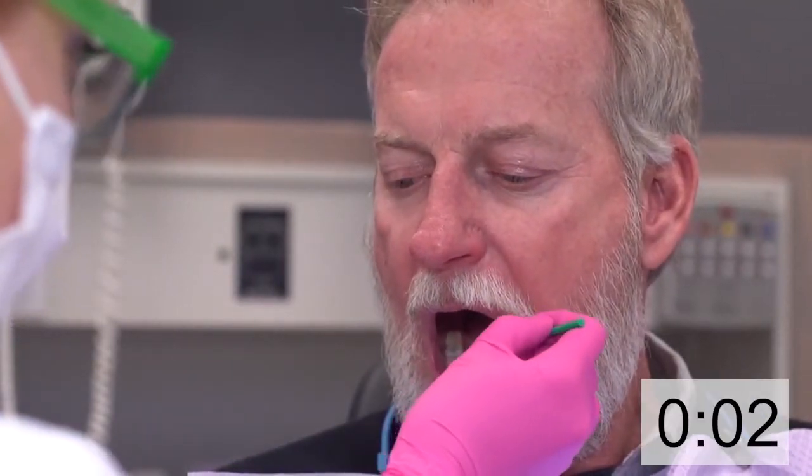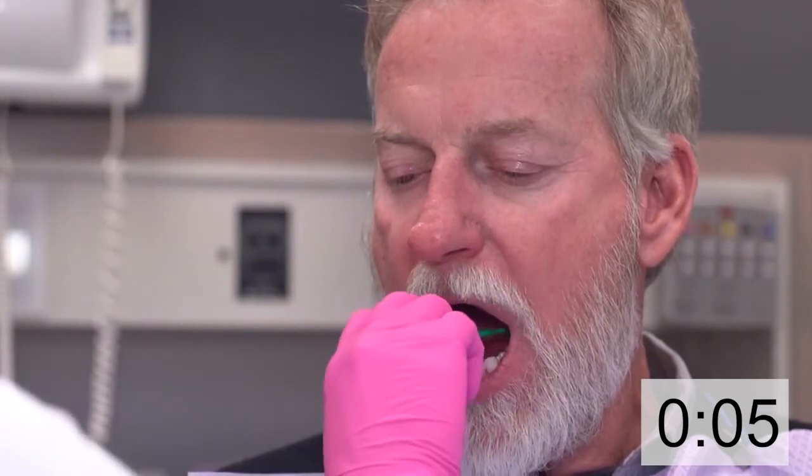Have your patient swallow very well, open, and look slightly down. I'm going to fill my applicator brush with a fluoridose, and I'm going to swipe it along the lingual arch.